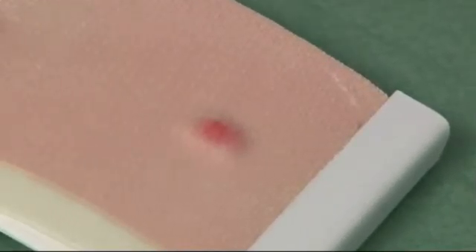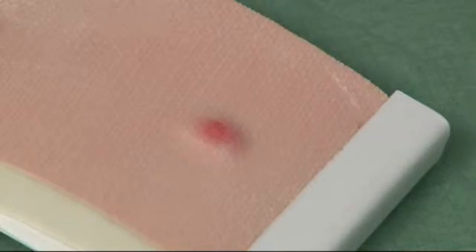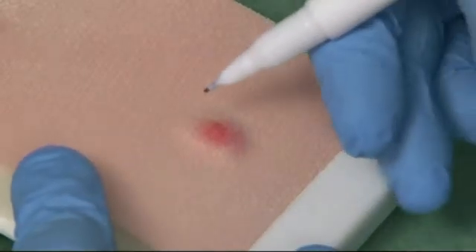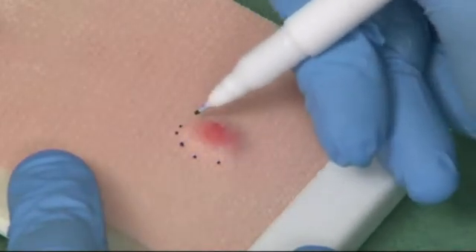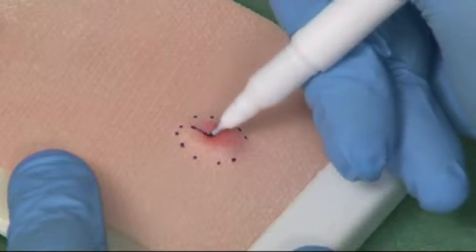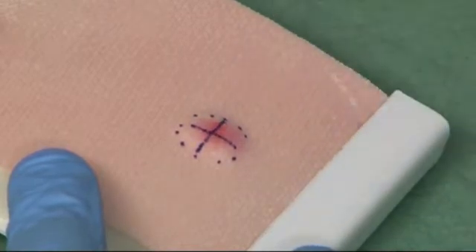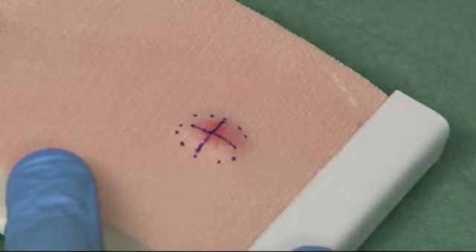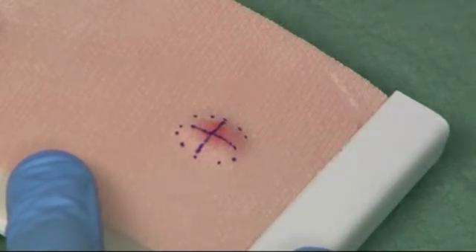We're now going to demonstrate how to incise and drain an abscess. Firstly, mark the area of maximum fluctuance with a skin marker for a cruciate incision. After infiltrating with local anaesthetic using a field block, a cruciate incision is made with the point of the blade.